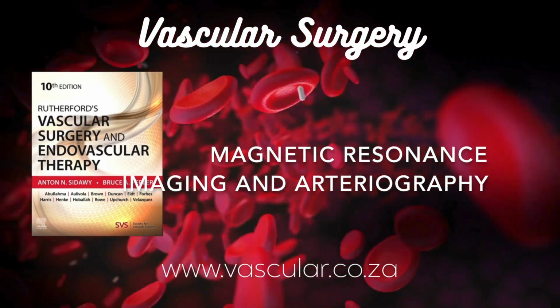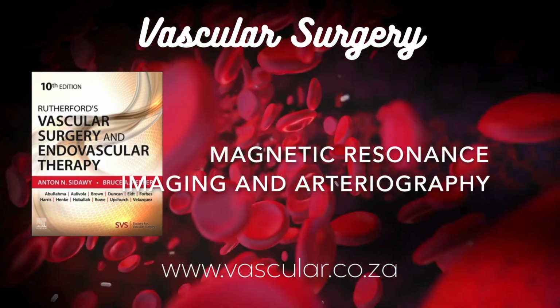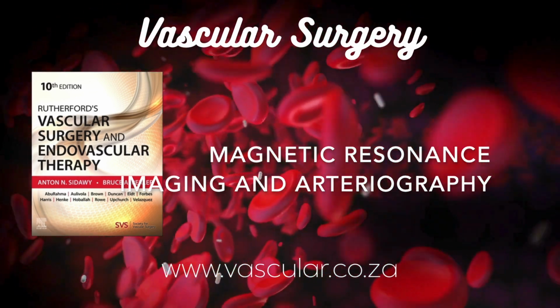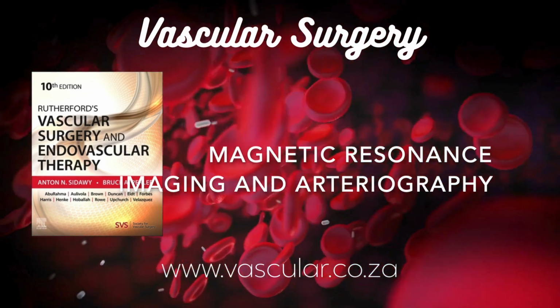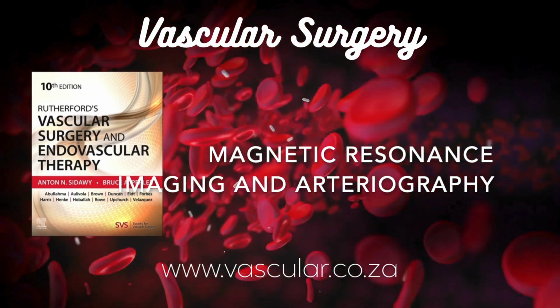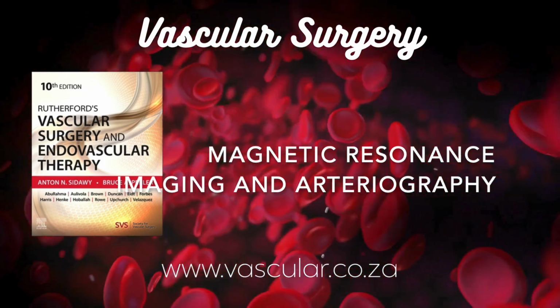Oh, absolutely. Even if safe, metallic implants can cause major signal voids, black holes, and distortions on the images. Stainless steel and platinum are often worse than nitinol. These artifacts can totally obscure the vessel inside the stent or downstream from it, making it impossible to reliably assess for blockage or narrowing. So safety is one thing, image quality is another. Right, a key distinction.